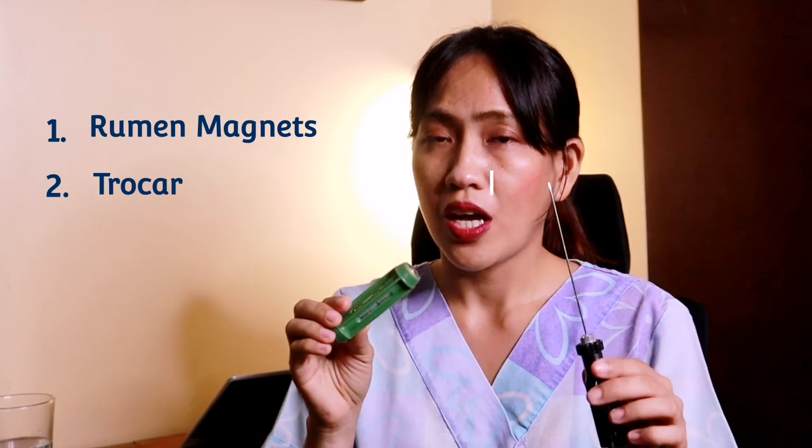This will prevent hardware disease, or traumatic reticular peritonitis, which causes metal objects such as nails to puncture the heart and other internal organs, leading to abscess formation and peritonitis. Of course, the affected animal will die if it is not detected soon enough, the metal removed, and the disease corrected. To recap, we have two products here: the rumen magnets and the trocar. Both are essential items for ruminants to prevent hardware disease and bloat respectively.